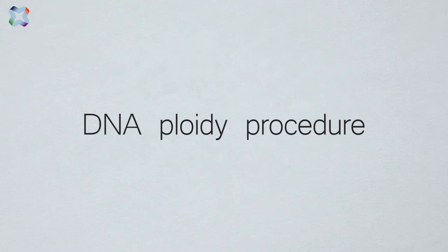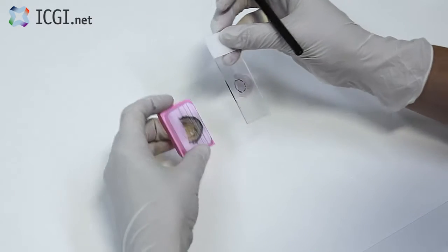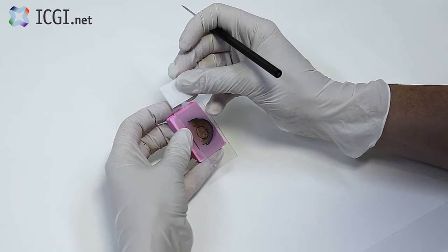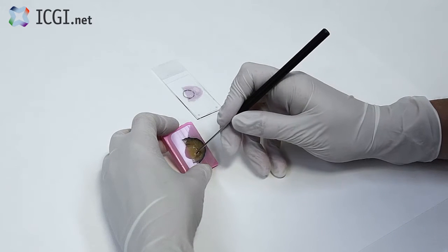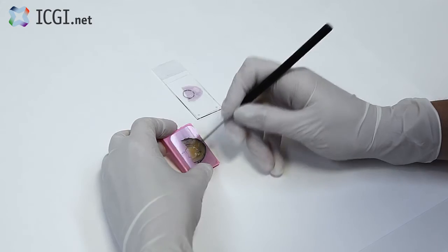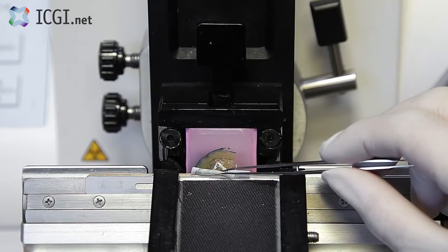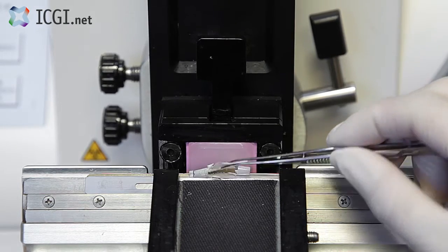This video will demonstrate the procedures used in DNA Ploidy analysis. Referring to the tumor area marked previously by a pathologist on an H&E stained slide, the corresponding tumor area of the paraffin-embedded tissue is outlined with a needle. The block is then cut in 50 micrometer thick sections.